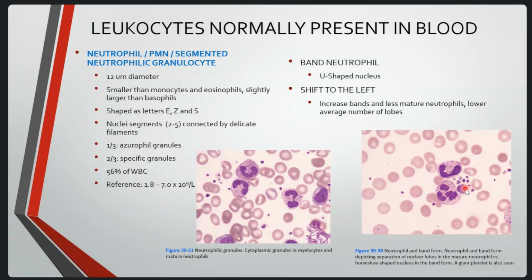We can also see here a giant platelet. This is not an RBC, this is a giant platelet.